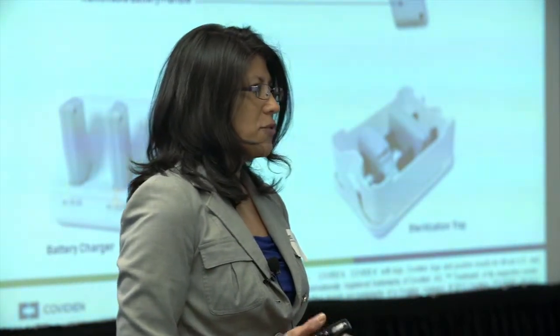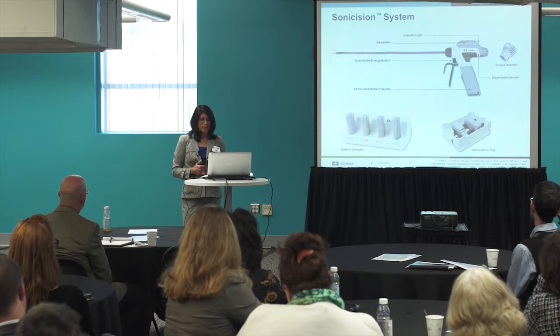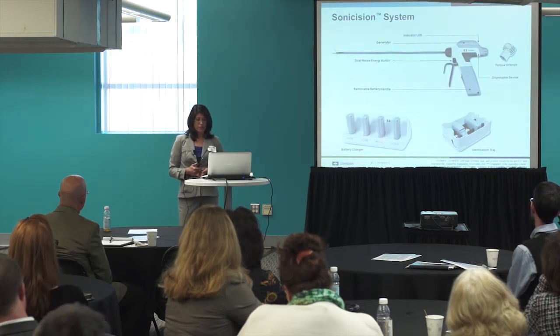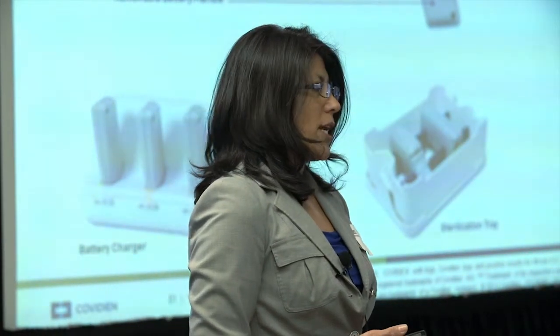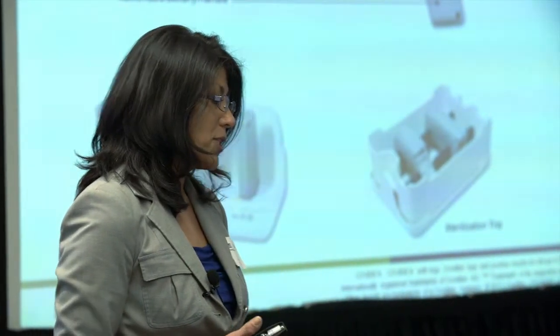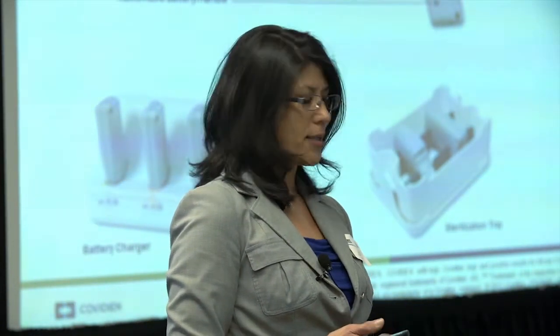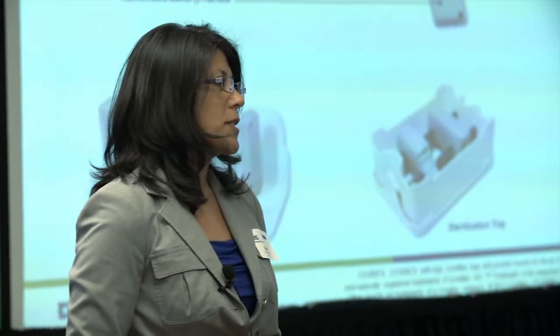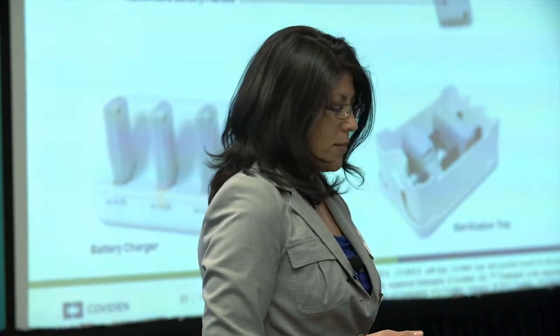Key UI features of the device, so user interface features of the device. I mentioned the colors, but also the indicators. There's a small speaker built in, and then there's an LED at the top of the generator. The controls themselves for surgical use, there's a lever that the surgeon can work to open and close the jaws to clamp on tissue. There's a rotation knob, which allows 360 degrees of rotation, or infinite rotation. And then there's a dual stage button. The device can provide ultrasonic energy in 2 different modes, both min and max. And then there's additional controls for assembly and disassembly, including a battery latch and then the rear torque knob at the back.